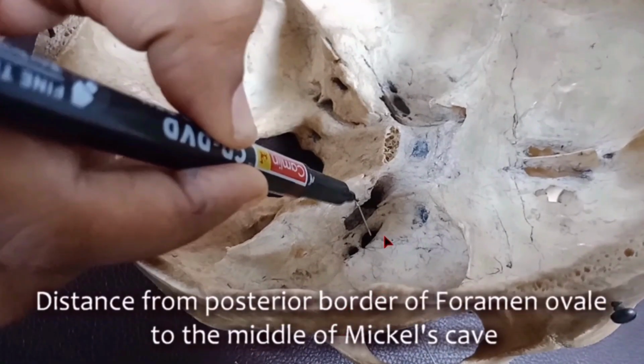Then she is taking the measurement of the distance from the posterior border of the foramen ovale to the middle of the Meckel's cave. If you are planning for ablating the ganglion, this may help you.